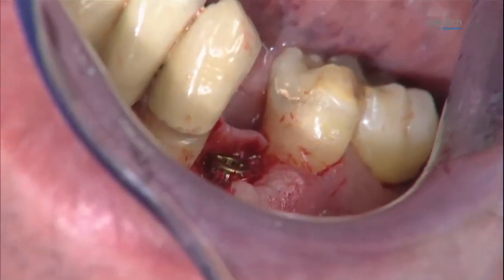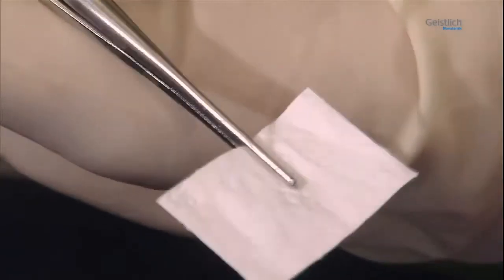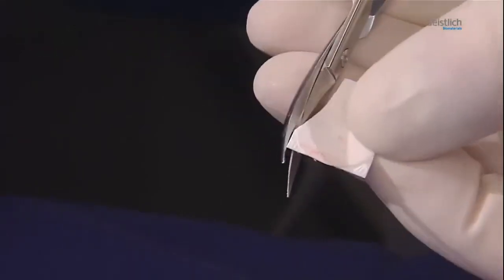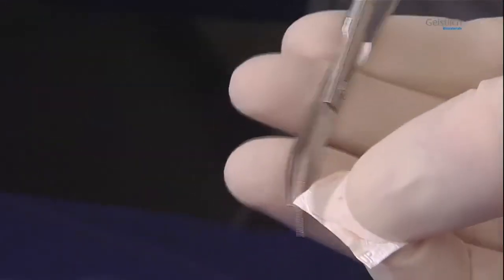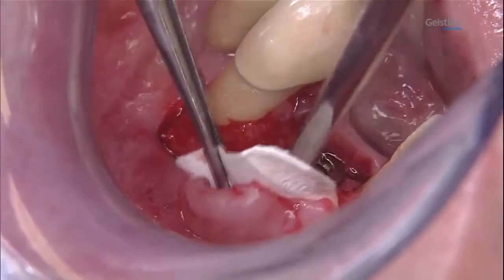The 16 x 22 mm Geistlich Bio-Gide has two differently textured sides. The outside of the membrane is marked with the embossed word "up". The shape and dimension of the template are now transferred to the membrane. The embossed "up" can be clearly seen here again. Once the membrane has been cut to match the template, its broader base is first pushed under the mucoperiosteal flap.